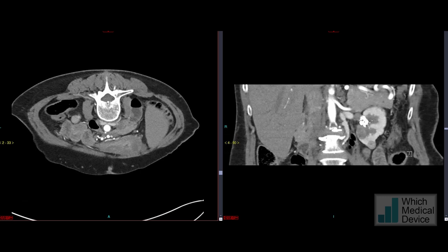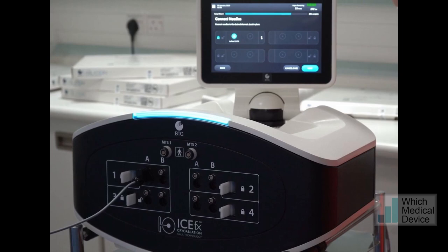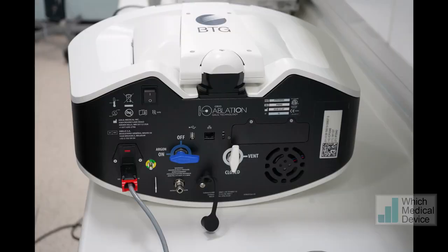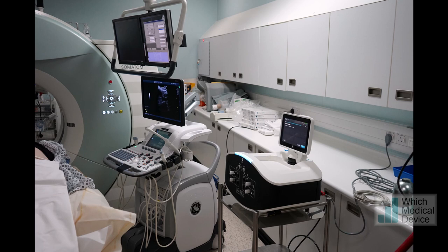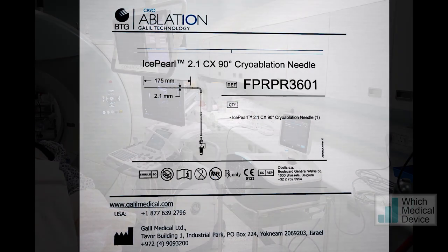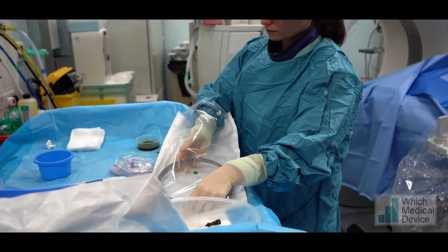This is seen particularly well on the coronal images. This is the BTG, now Boston Scientific, cryoablation machine we're going to use called the ICE-FX. It's a particularly neat small desktop machine that allows you to use up to eight ice needles or probes with four channels. Here we're going to use the ice pearl, which gives a quite small but very spherical ablation — sufficient for this small renal lesion.